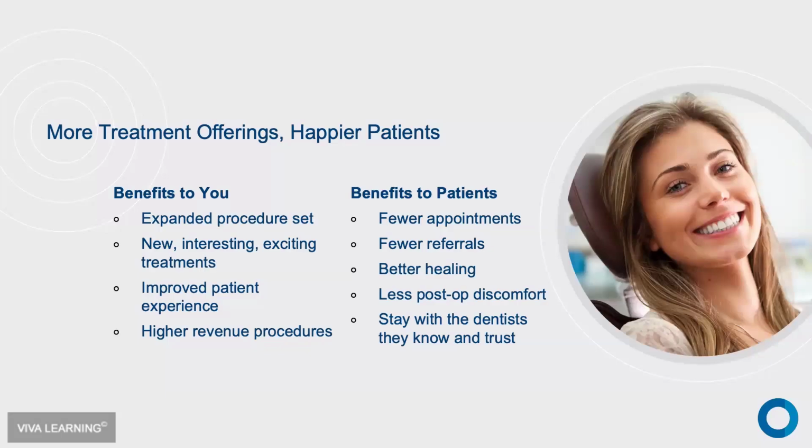And I would expect final healing within a week. So we're talking about a week or less healing time from actually bony removal, crown lengthening type procedures compared to 8 weeks. And the benefit to the patient, it's then their primary provider who's doing it, and they don't necessarily have to go to another office if you're already doing this.